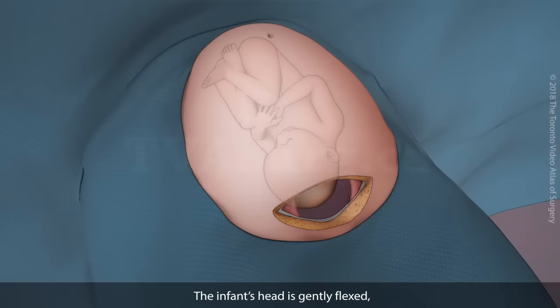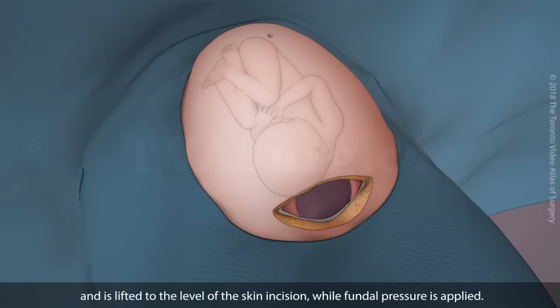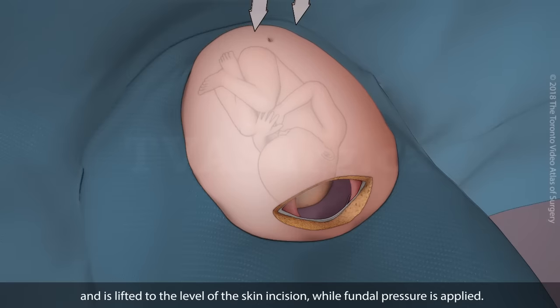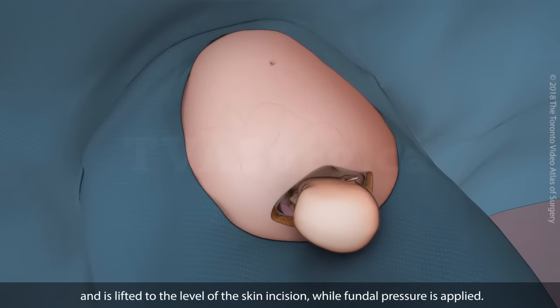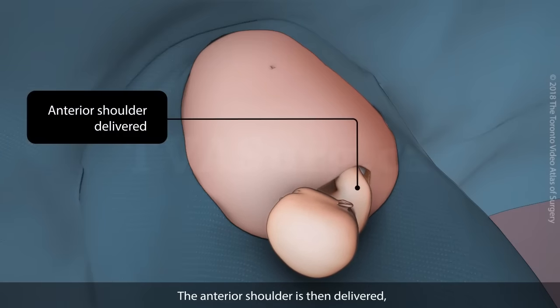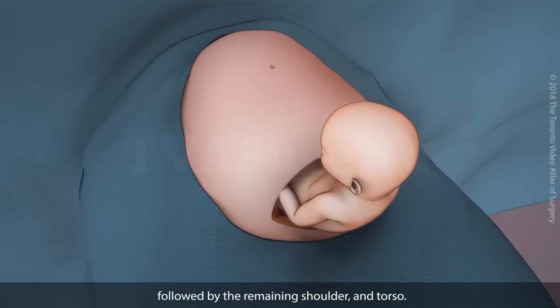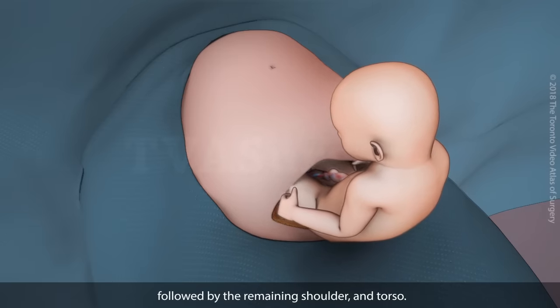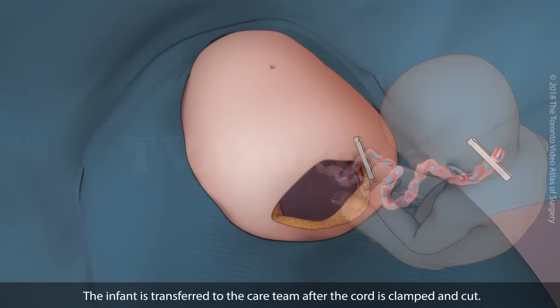The infant's head is gently flexed and is lifted to the level of the skin incision while fundal pressure is applied. The anterior shoulder is then delivered, followed by the remaining shoulder and torso. The infant is transferred to the care team after the cord is clamped and cut.